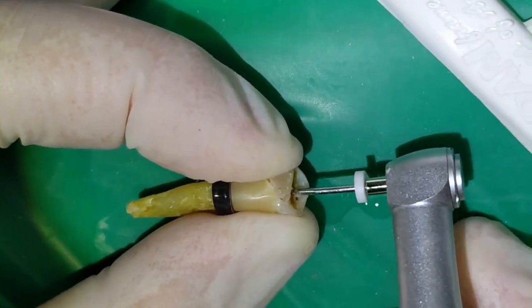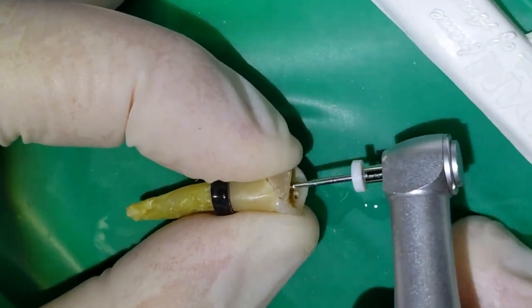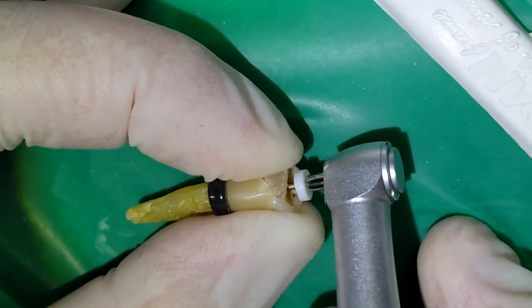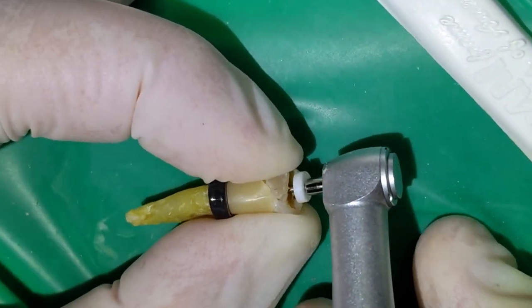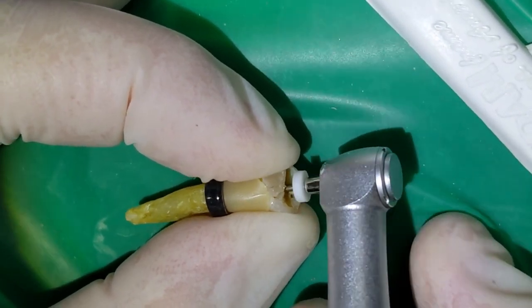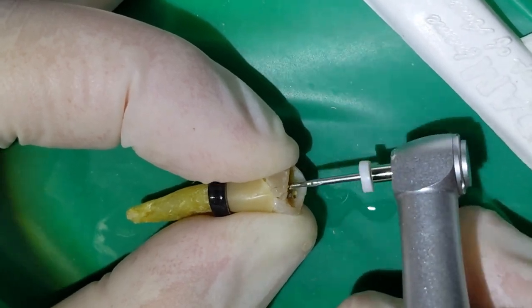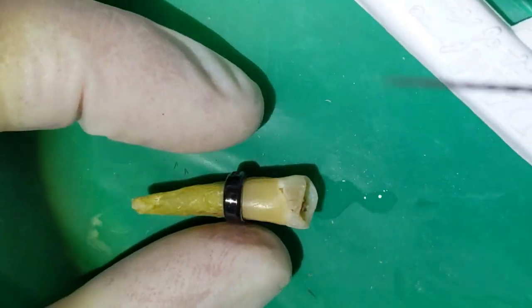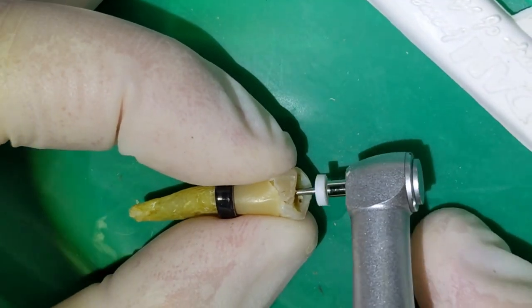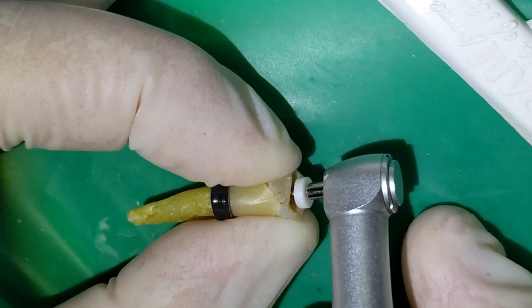This is an older file. I don't use these very much anymore. I've switched pretty much all to the real flexible nickel titanium ones, just personal preference. I always found this kind of herky-jerky reciprocating motion a little kind of freaky. Let me clean that off. So this is just an old file that I had left over. But again, we worked it all the way down to number 40. Great.